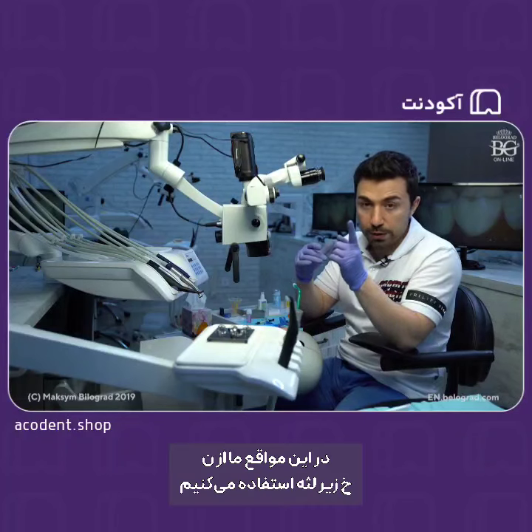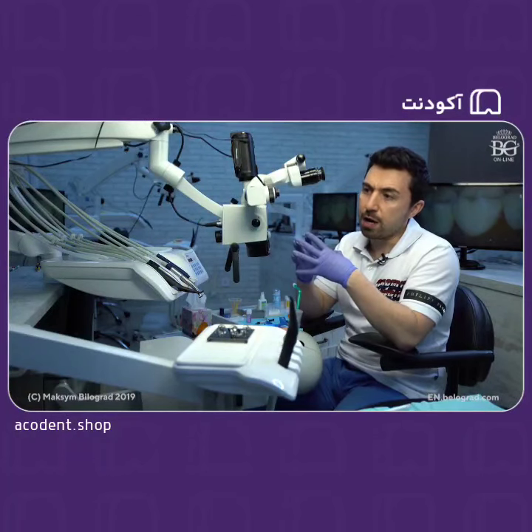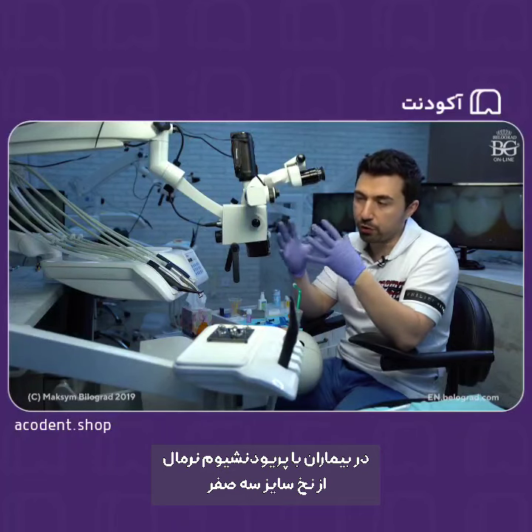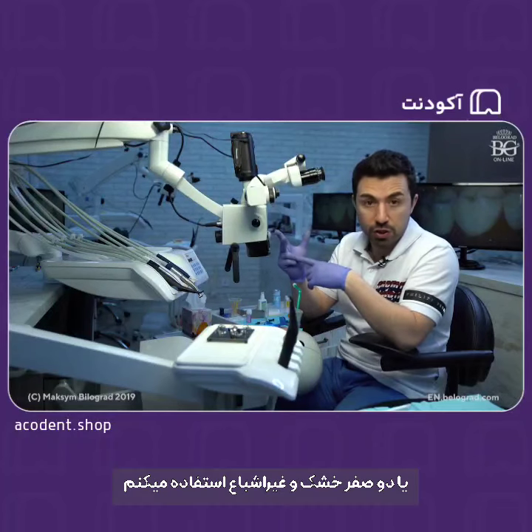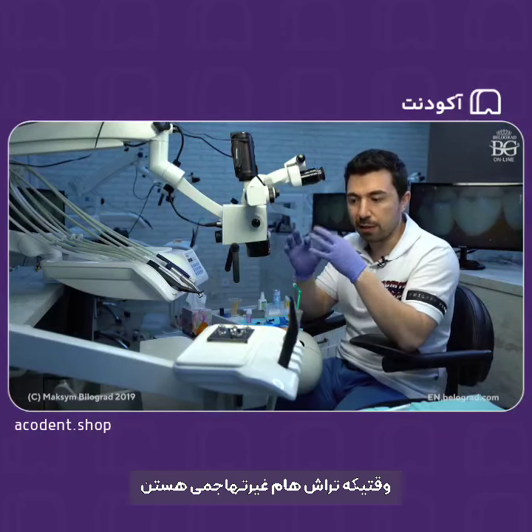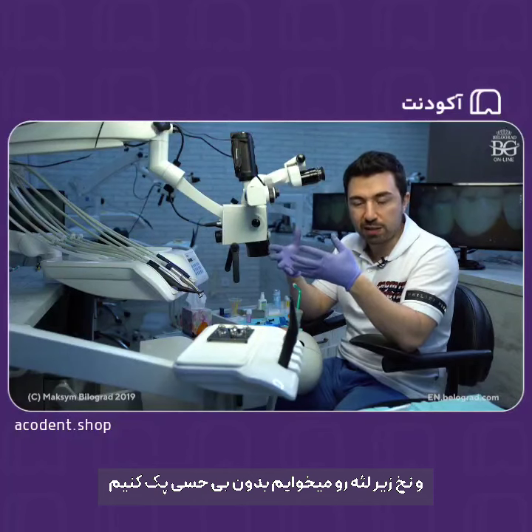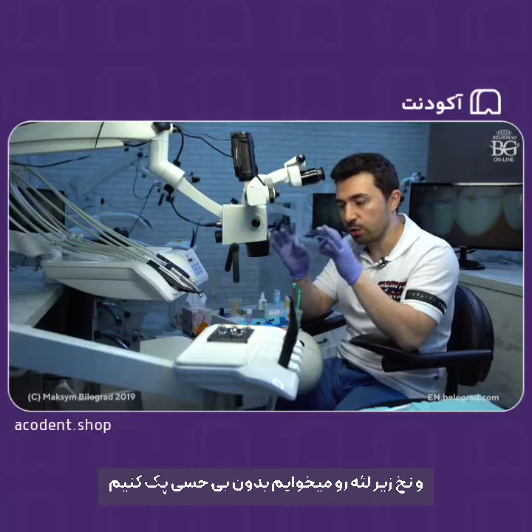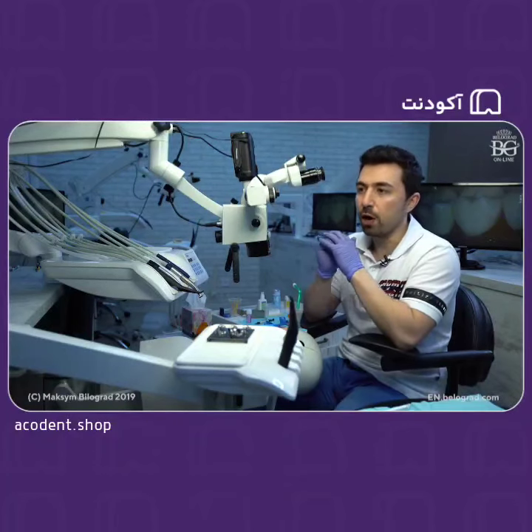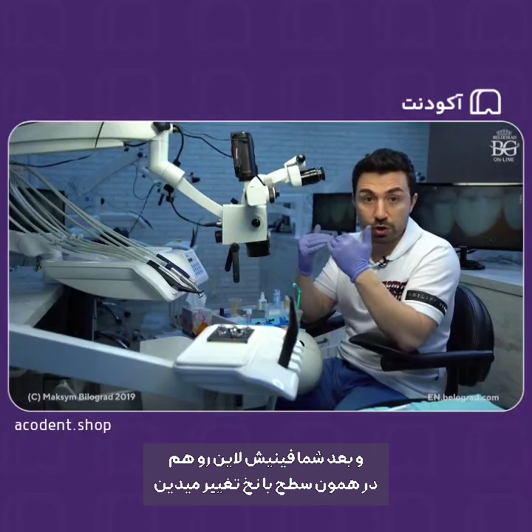We put in a retraction cord. It depends on the biotype. But in almost all of my cases, in normal periodontium, I use a 000 or 00 dry non-impregnated retraction cord, packing this cord really gently. Sometimes when my preps are really non-aggressive, the preparation is done without anesthesia, and you put in the retraction cord also without anesthesia and the patient is okay with that. So you have to pack really gently. Then you move your finish line to the same level as the retraction cord.